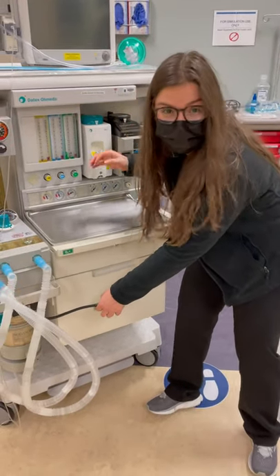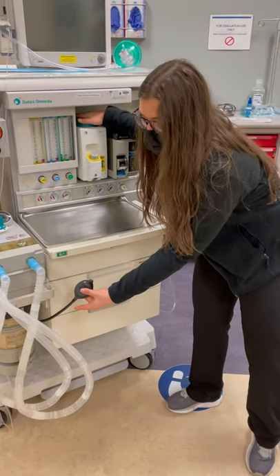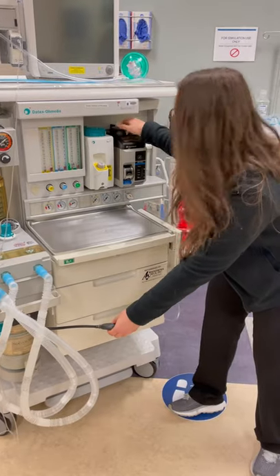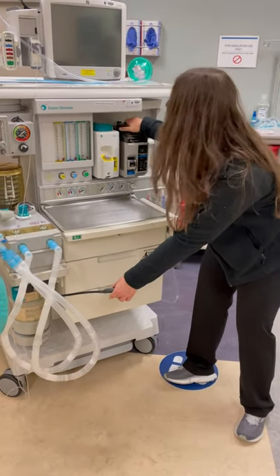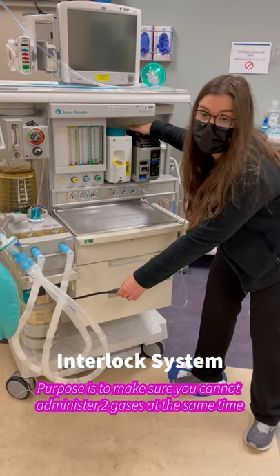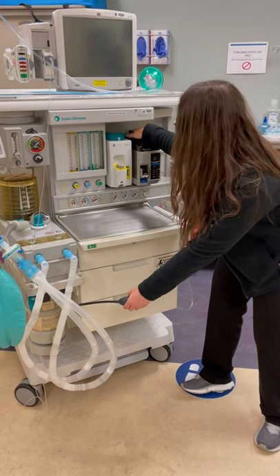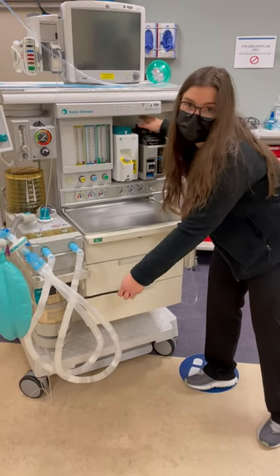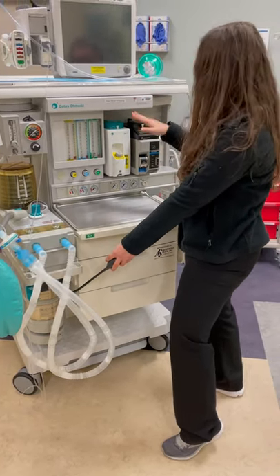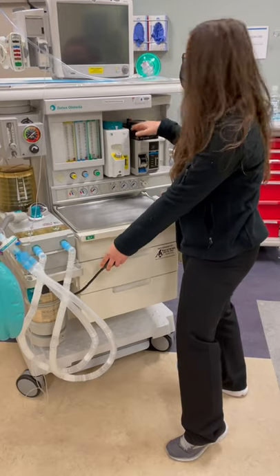Now I'm going to check the interlock system. First, I'm going to crack the sevoflurane and occlude my bulb — cracking the sevoflurane, making sure that when I introduce a vaporizer into the manifold there are no leaks. During this time, I'm going to try my interlock system, which makes sure I can't open my desflurane while my sevoflurane is on. I can't do that, so my interlock system is working. I'm going to close my sevoflurane. Note: if the desflurane was beside the other vaporizer rather than in its proper position, the interlock system wouldn't work and technically you could still turn on both gases at the same time.